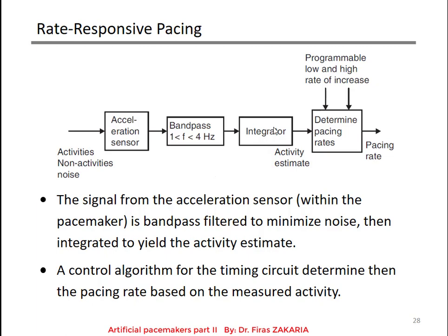The integrator performs the mathematical operation of integration with respect to time, so its output voltage is proportional to the input voltage integrated over time.